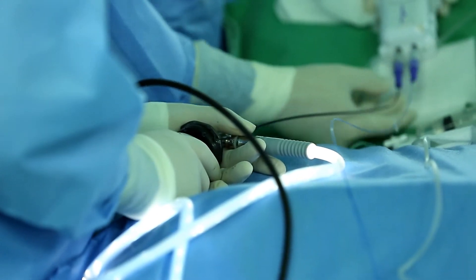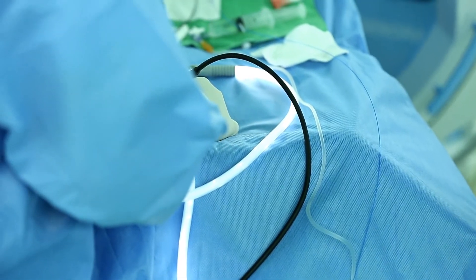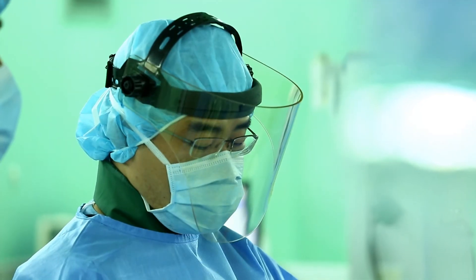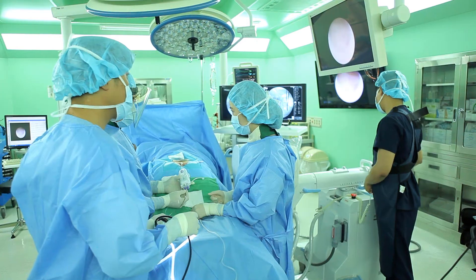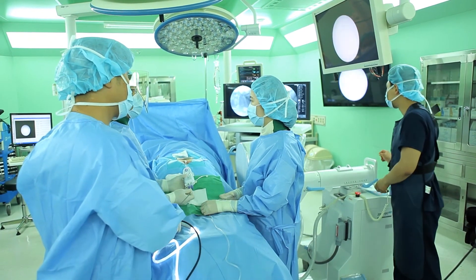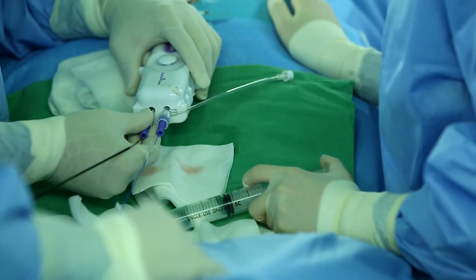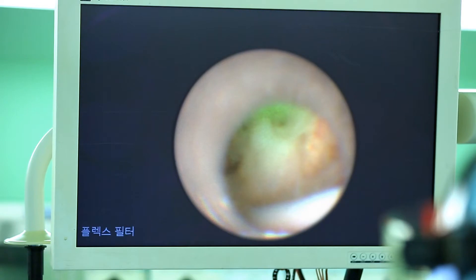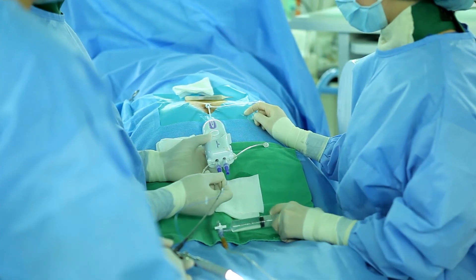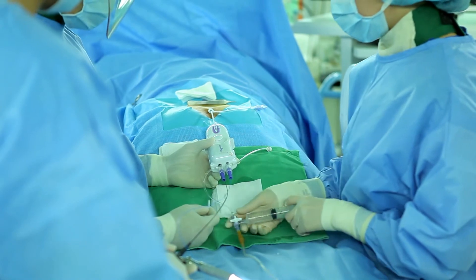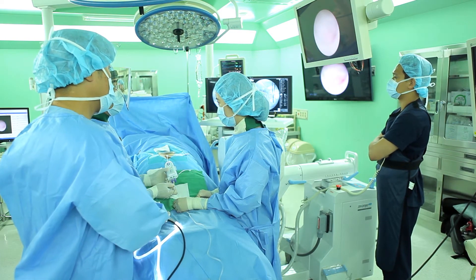The endoscopic cable is a consumable. As it is being used, the resolution will become poorer and poorer. The skillfulness of SELD will make an impact on the shelf life. If it is of too low resolution to be used, it should be replaced. If not, you may clean the view by pushing saline. If the view is interfered with by epidural fat, you may repeatedly insert and take out the endoscopic cable while pushing saline to remove the epidural fat.